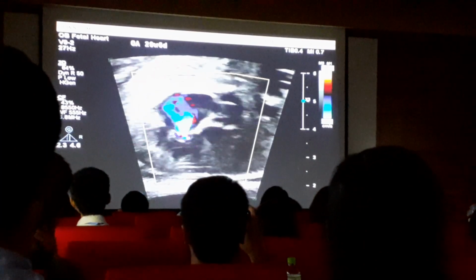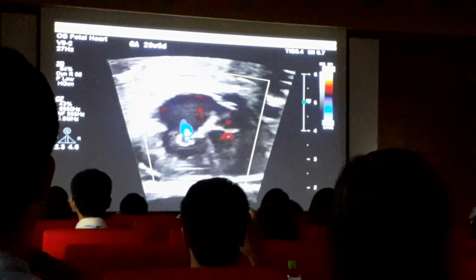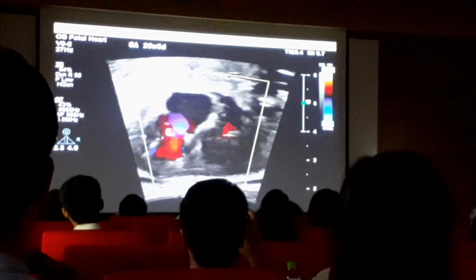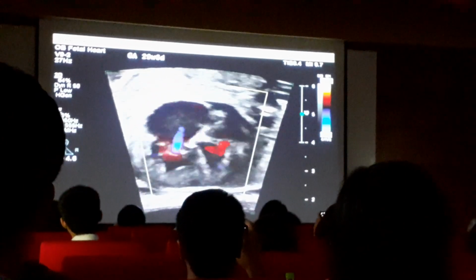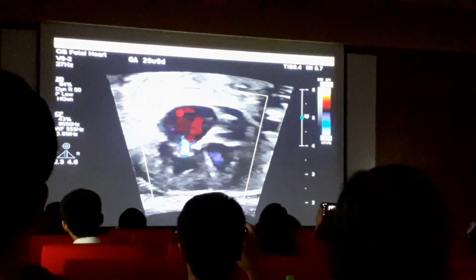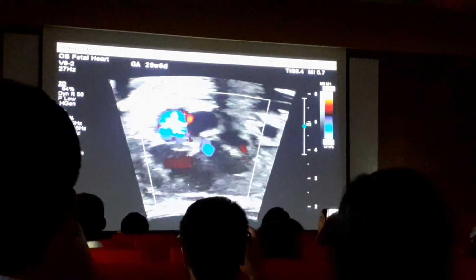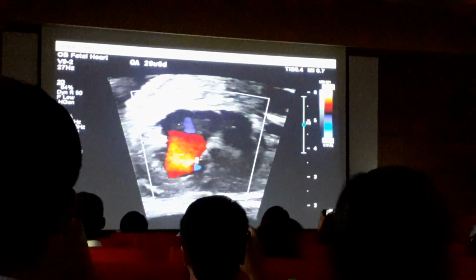Quantification of this is debated, but there is associated right atrial enlargement, so I would say at least moderate, possibly severe, maybe moderate based on the vena contracta width. Cái tiêu chuẩn đánh giá mà hở vành ba lá thì nó còn nhiều tranh cãi, nhưng mà mình thấy với cái mức độ như thế này cộng thêm cái giãn nhĩ phải thì cái này có thể là mức độ trung bình hoặc là trên trung bình. So after looking at the color Doppler, of course we're going to add our spectral Doppler. Mình sẽ coi cái Doppler phổ.